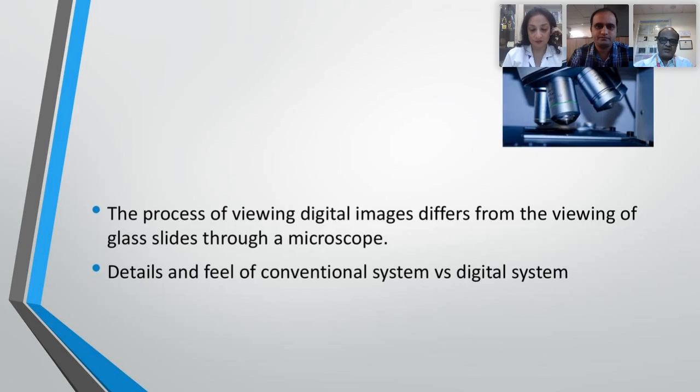The second important thing, I'm talking now about the advantage: whenever you have a leukopenia and your patients are also pancytopenic, and you want to pick up blast cells, I vouch for the digital imaging rather than the microscope itself, because it is able to give us unclassifieds. It is also able to give a blast. Go for the image bank, check it up, and then you can sign out the leukopenic samples where you have a low blast count.